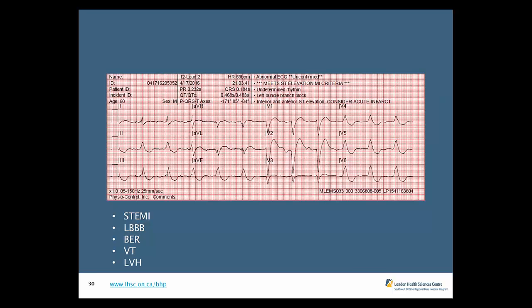There is ST elevation, I agree. But looking at what's probably perceived for those who thought this was STEMI as what is thought to be ST depression. ST depression is a bit of an overarching term, and yes, the ST segment does depress below the baseline, but this is what's seen in that strain pattern or repolarization abnormality. So going back to those features which Mike alluded to, negative deflection in your rightward leads, your right more precordial leads, V1, V2, versus that widened potential RR prime in V6 with that scooped ST depression or strain pattern in those leads is more in keeping with a left bundle branch block.